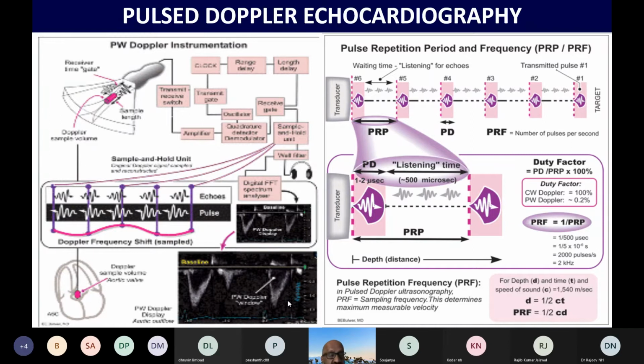This is like in old movies, or even a fan rotating on the roof at lower speeds. When the speed is increasing, sometimes you will see that the fan is initially moving in one direction, but with increased speed you apparently falsely perceive that the fan is moving in the opposite direction.